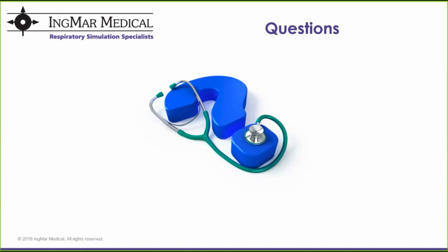We have a couple of questions regarding the scope of mannequin integration available. Essentially, these questions are asking if we are currently limited to adult mannequins or if there is an opportunity to integrate with pediatric or neonatal mannequins. Currently, we are compatible with those 4 mannequins that I mentioned, the 3G, 3G trauma, essential, and essential bleeding. Those are all adult mannequins.